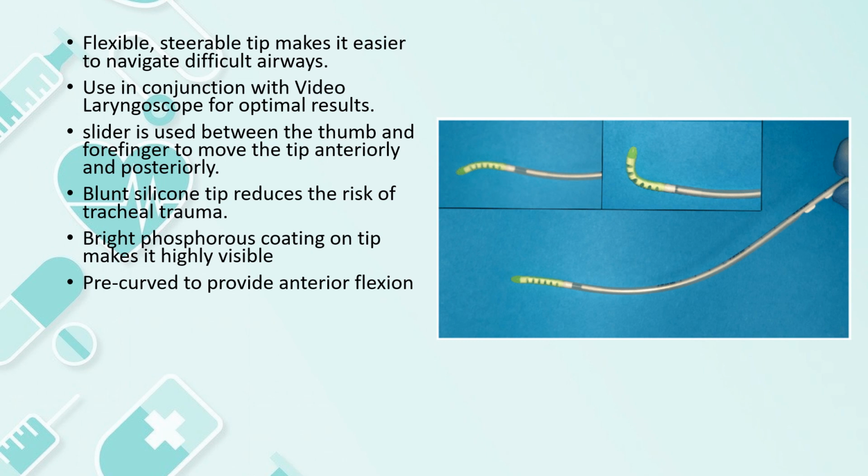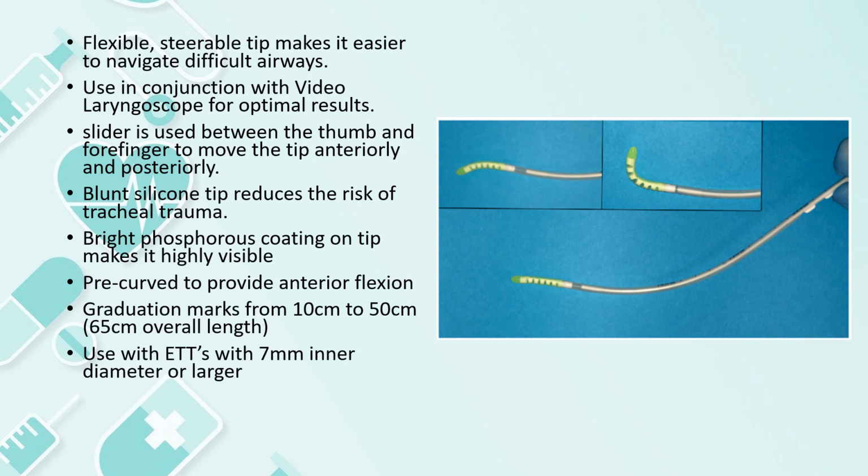And it also has a pre-curved configuration. Graduation marks from 10 to 50 centimeters. It can be used with an endotracheal tube 7 millimeters in diameter or larger. It's sterile and single use.